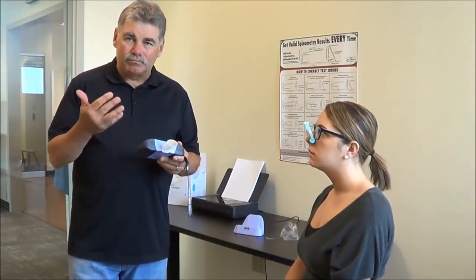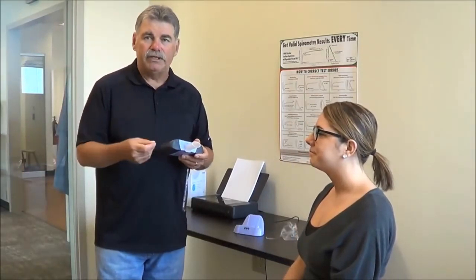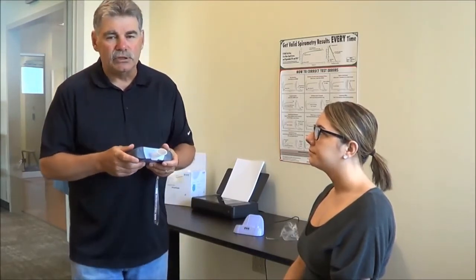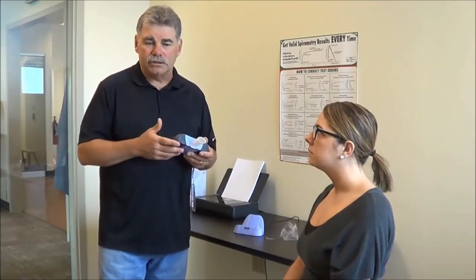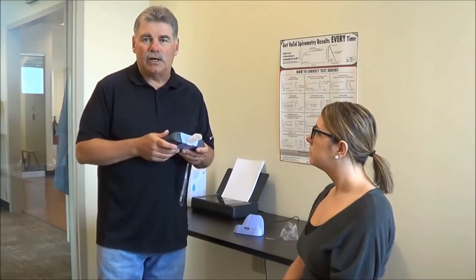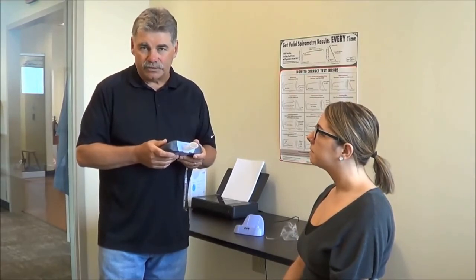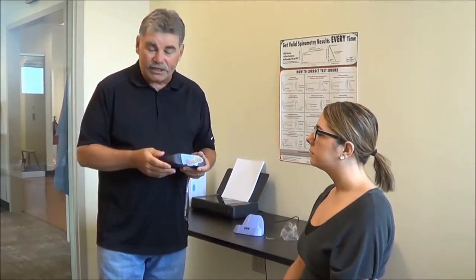Now, you can do up to 8 trials to get to this point. In this case, Tina is a very good student, and she understands how to do the test, so it was quite easy for me to get a good grade after 3 blows. It could take you more. And usually what happens is those first couple of trials, maybe the patient is still figuring out how to do this, or you're figuring out how to coach and get them to do the things correctly. So ATS says go up to 8 trials. We were fortunate to get that done within 3 trials. So at this point for my pre-med spirometry, we're actually done.